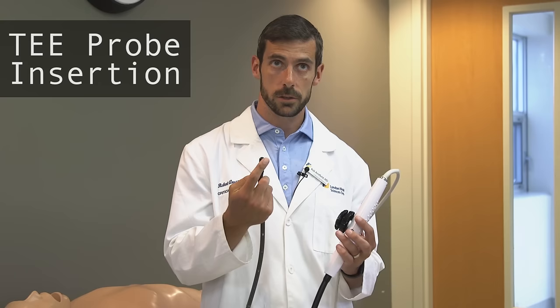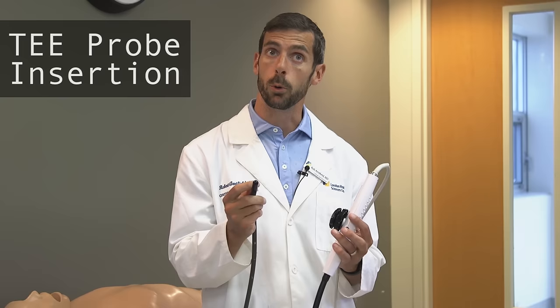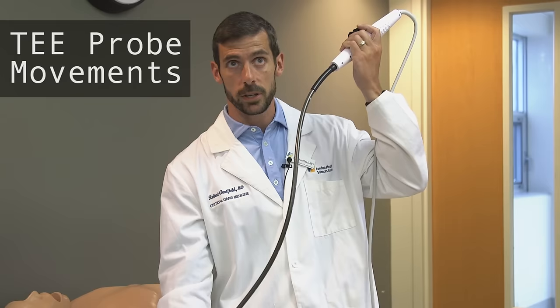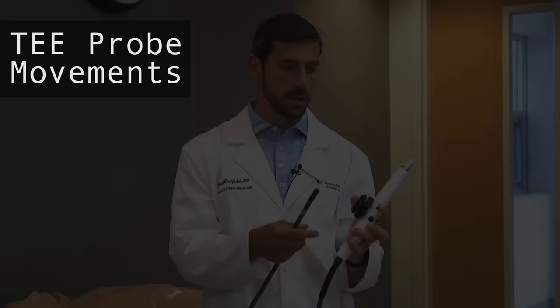For insertion, as we will show you in vivo shortly, the surface the crystals are on — which is a flat surface — will face the floor of the mouth upon insertion, and that will ensure the appropriate location in the patient. With this transducer being long and endoscopic, we can advance or withdraw the transducer, and we can also rotate it on its own longitudinal axis.